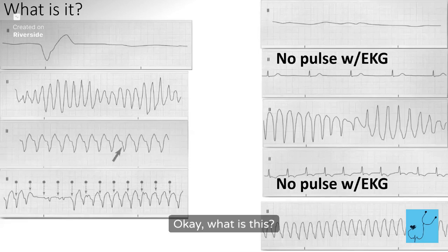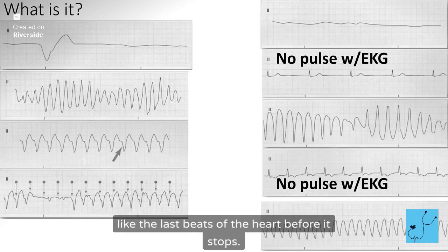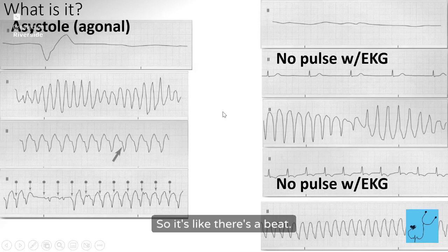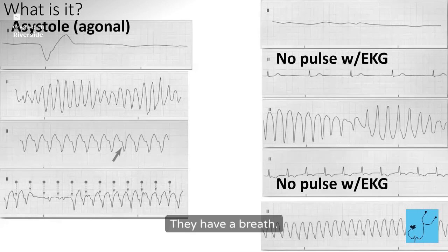Okay, what is this? Yeah, that's kind of bad, right? So if we had more than one of these, it would almost be like idioventricular, where it's like the last beats of the heart before it stops. We also call it agonal. So it's like there's a beat, there's another beat. It's the same thing when someone says they're agonal breathing. They have a breath, you wait and you think they've died. Oh my God, there's another one. We call those agonal.